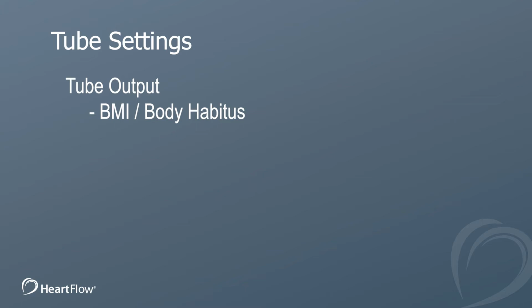We have to consider sometimes that patients have complex scans because of coronary calcifications or stents. And in these situations, we need to consider provisionally upping the tube settings regardless of the patient's body habitus, because dense calcification can affect your image quality. And calcification plus motion can be particularly problematic, and it may influence your decision to sample more phases.